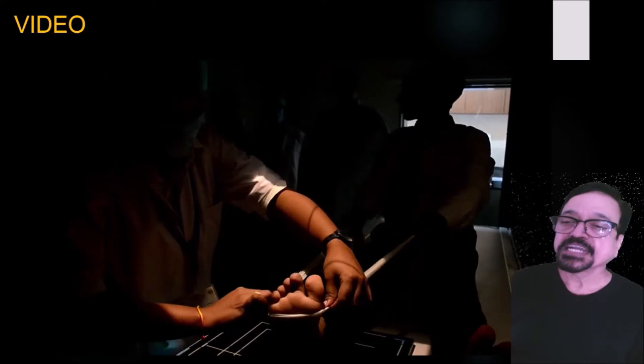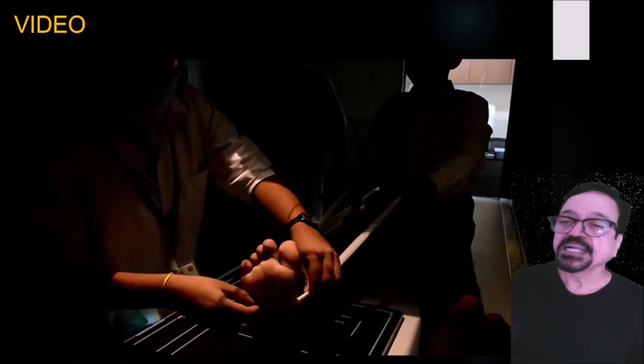Now let us see in the video how it is done. Instructions to the patient are important in this — the patient has to follow your instructions. The technical aspect is also slightly difficult; otherwise the sling will come out. We have to take it slightly down and it should rest there. Sometimes you may not get an adequate angle with all this maneuvering.